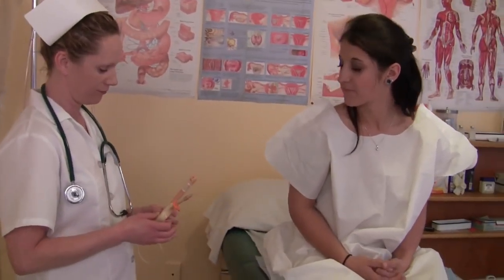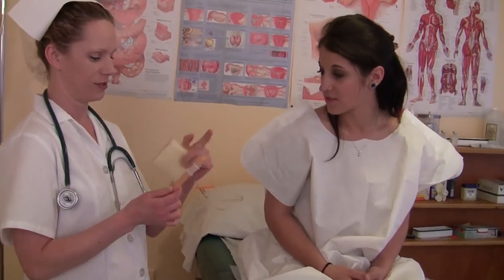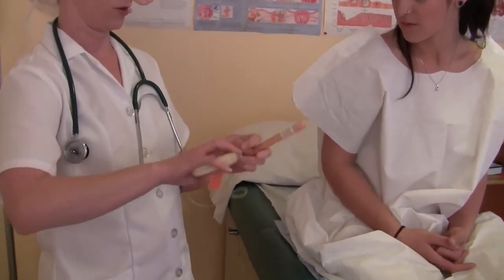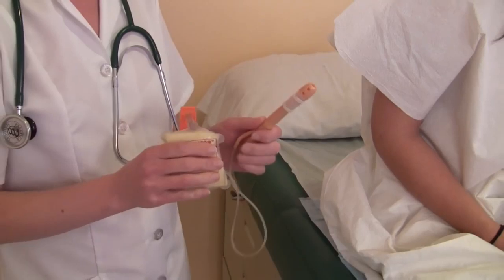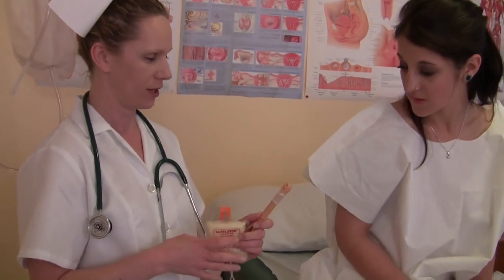Now we're going to use this inflatable cup. We're going to insert the tip to about right there. And after we insert it, we're going to inflate this little balloon right here. And that way it will help you hold the water longer and keep it from slipping out or anything like that.